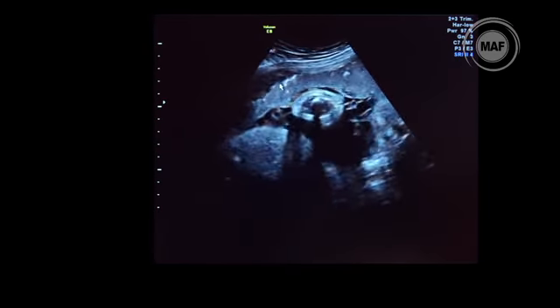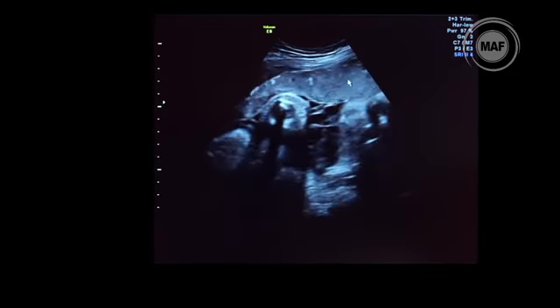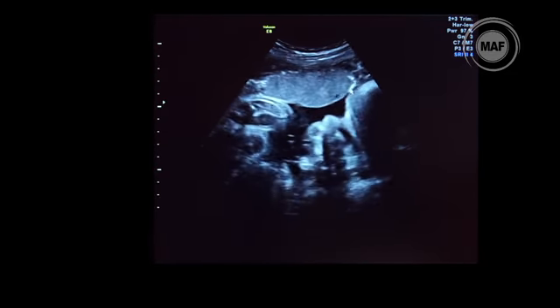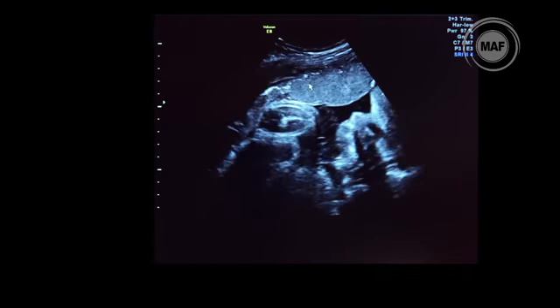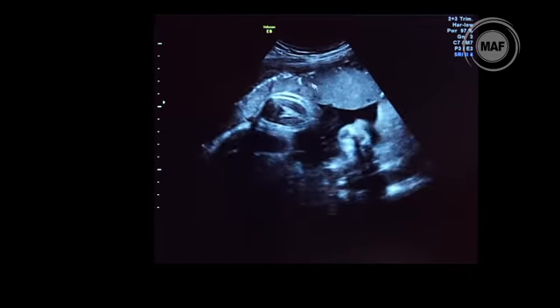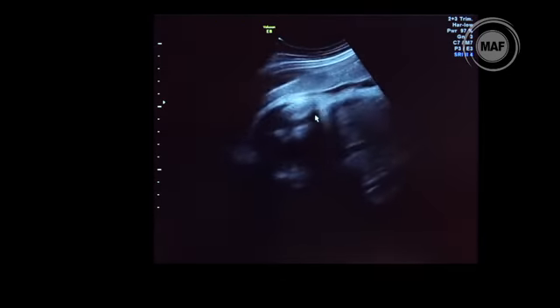As the pregnancy progresses, or the placenta matures, and this is completely normal findings, yeah, at this stage of pregnancy. If you see this early in the pregnancy at 20-25 weeks, then one would get worried about this. But at this stage, it's a completely normal finding. And I can show you.